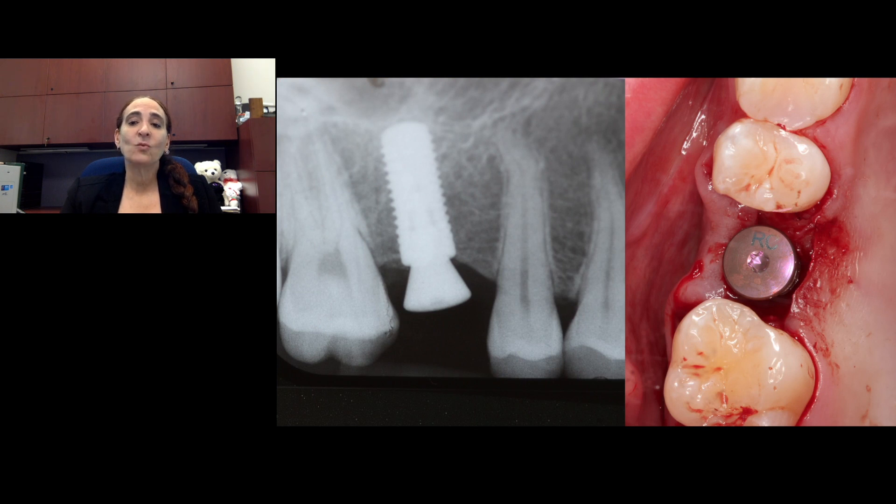This was a case where we decided to place it one stage, so it's going to have a healing abutment placed. We can have very high confidence that this is going to be a stable implant long term.